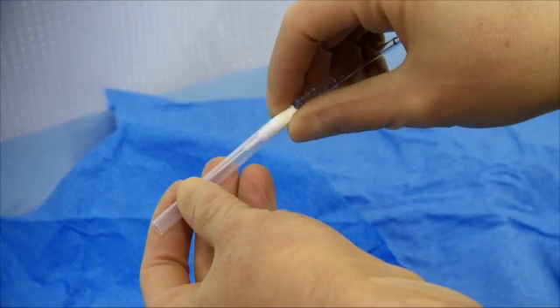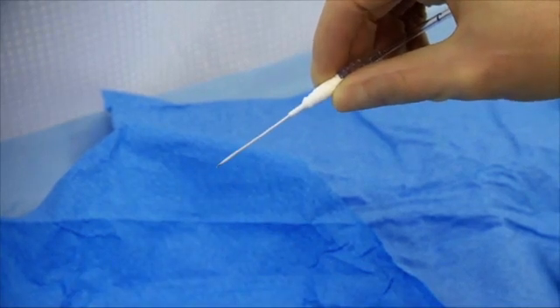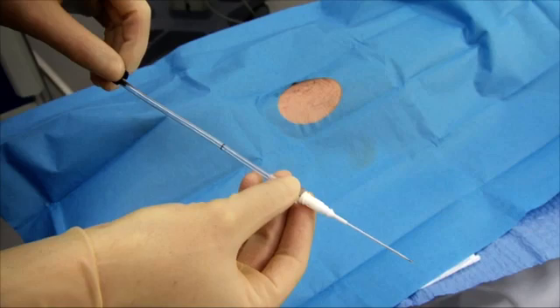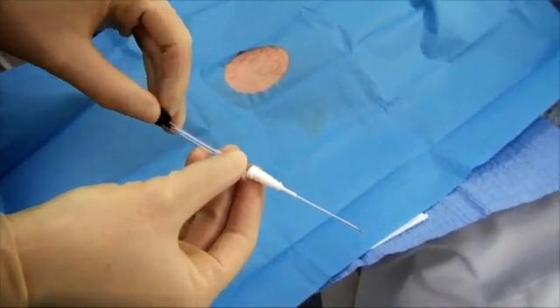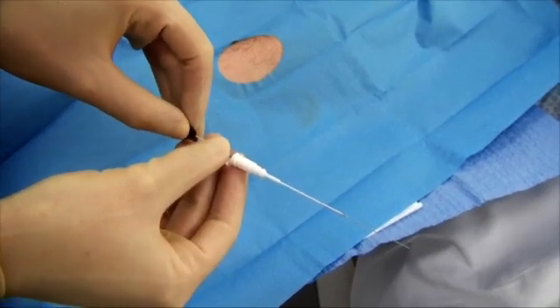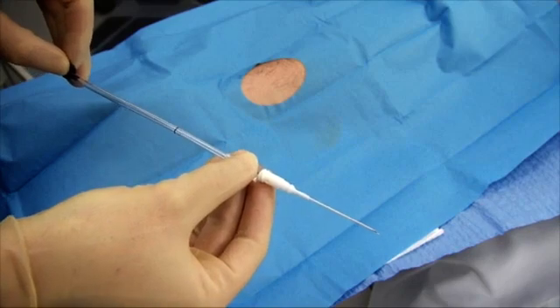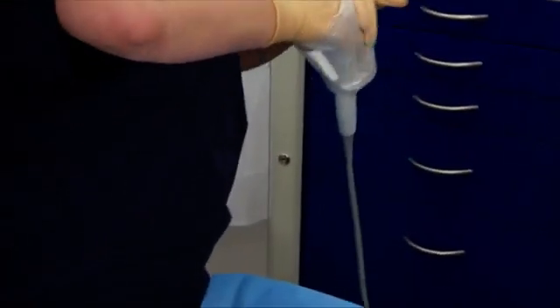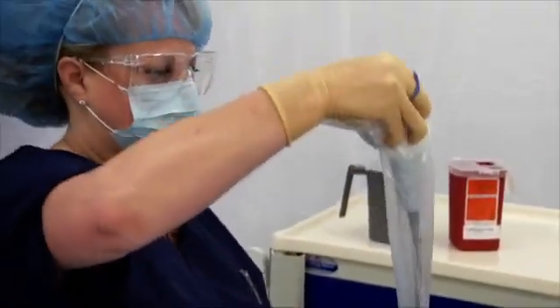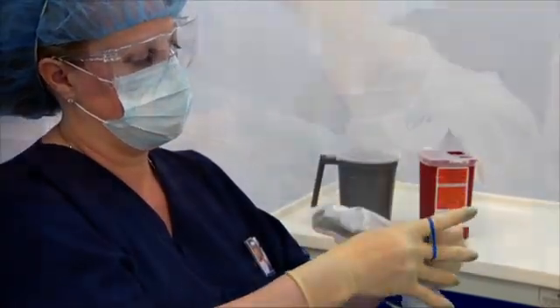Now we will review the catheter prior to insertion. Remove the protective shield from the placement device. Be sure to test the advancement and retraction of the spring wire guide through the needle using the spring wire guide handle to ensure proper function. Prior to insertion, the spring wire guide handle must be returned to the original position or blood flashback may be inhibited. Next, don a sterile probe cover using sterile technique. Once covered, the probe needs to be maintained on a sterile field.